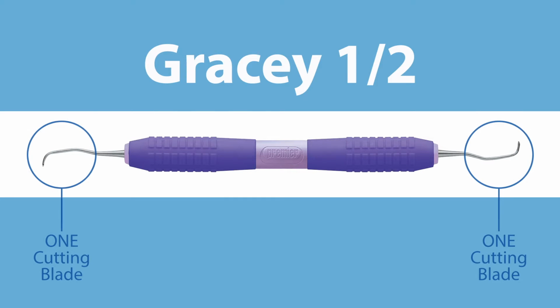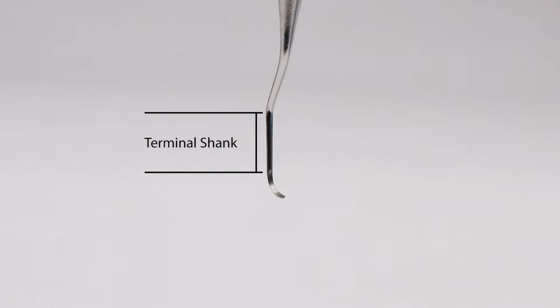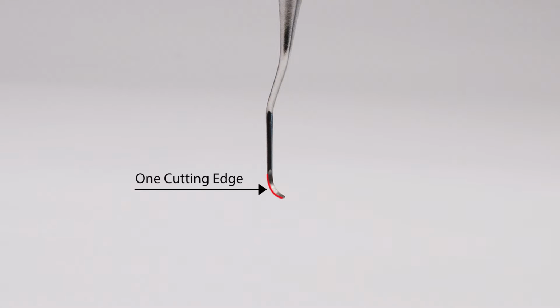All Gracey curettes are designed with one cutting blade on each opposite working end. The Gracey 1-2 curette has a straight shank from the handle to the toe of the working end. The terminal shank is the lowest section on the overall shank, which is closest to the working toe. The cutting edge is identified when the instrument is held straight up with the terminal shank positioned perpendicular to the floor. The lower edge of the offset blade is the cutting edge.